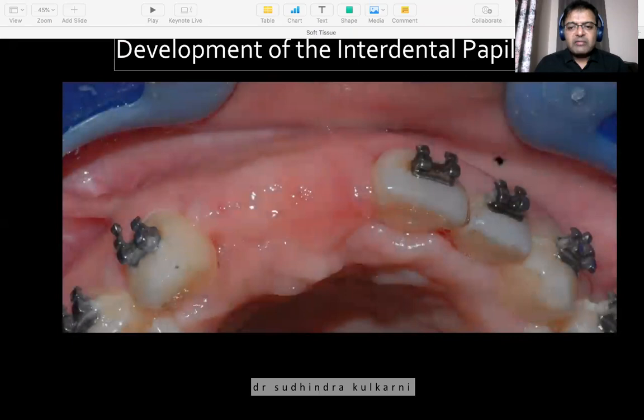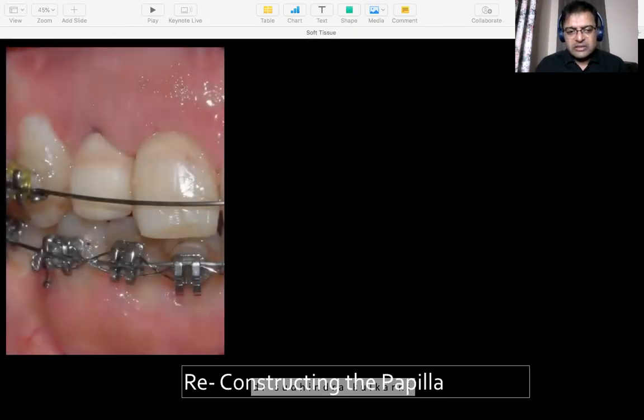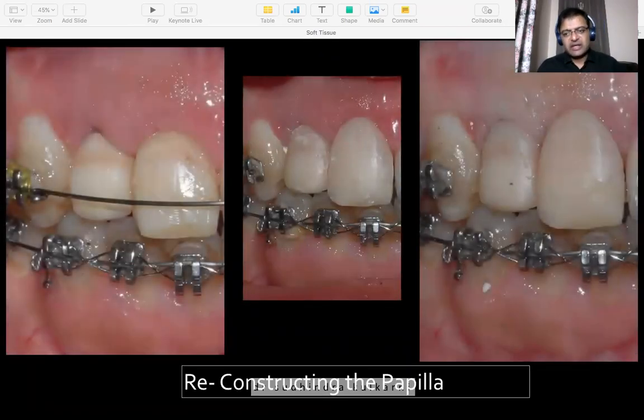Very, very critical are adjacent missing teeth. When you have sites with adjacent missing teeth and you are placing 2 implants, it's very, very crucial that you also get the inter-implant papilla. If you don't get the inter-implant papilla, then you are struggling for aesthetics. And if the patient has a high lip line and is very demanding, then it's a big, big task.